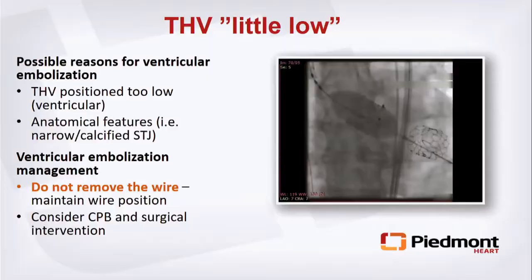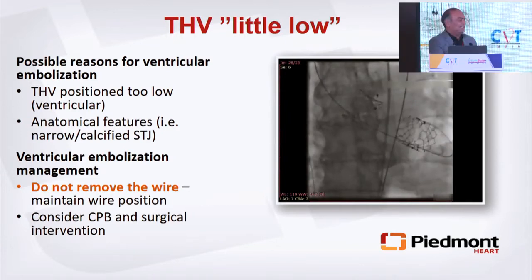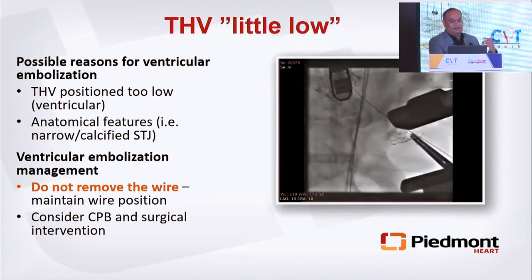So back to too little or too low or too high, right? Even the Sapiens can be too low or too high. I'm going to show you a few case examples, and then I'll show you the next generation of Sapien that's going to come out. So this valve embolized in the ventricle because it was placed lower than usual, either because the position was low or because the narrow STJ pushed it down. And as the second valve was brought in, it fell in the ventricle.